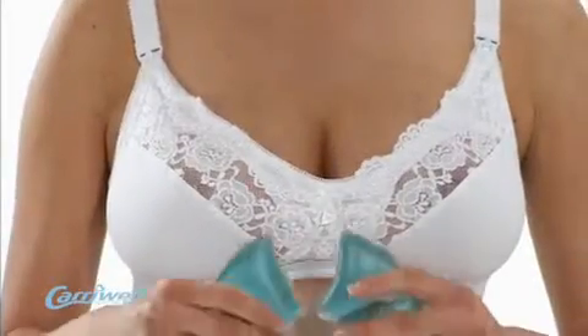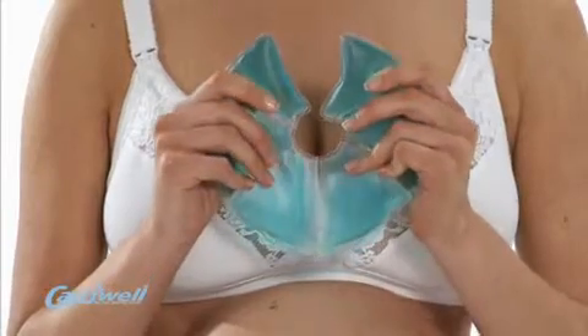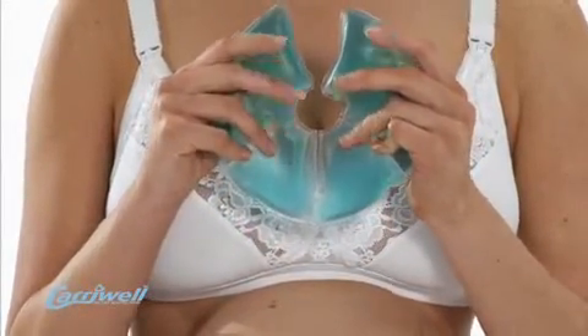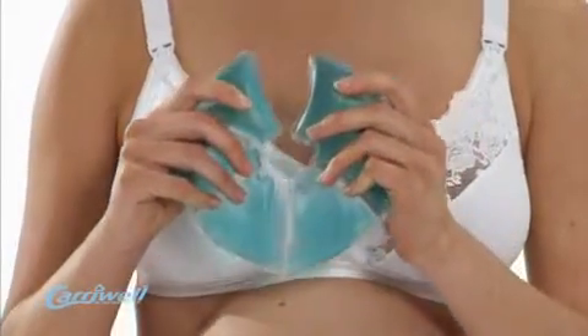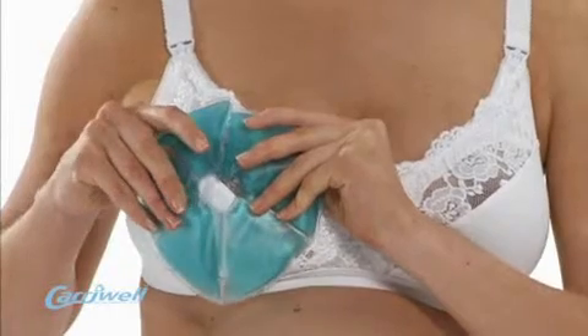The Carrywell Breastsoother has been specifically designed to soothe the sore breasts of women who are breastfeeding. The unique thermal properties mean it can be used in either a warm or cool therapy, depending on personal preference, and is soft and flexible, fitting comfortably over the breast.